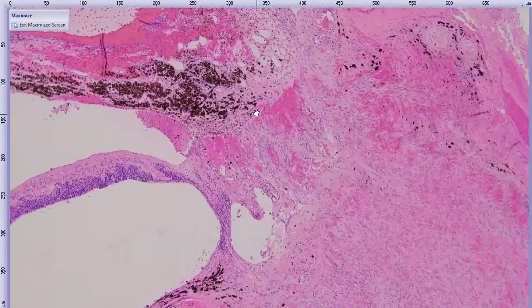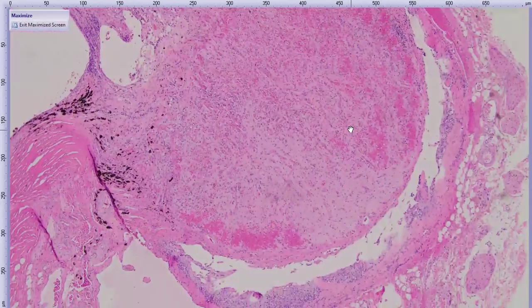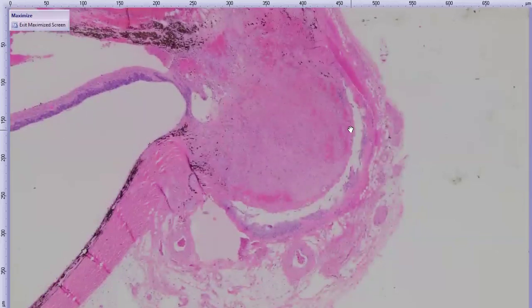Our optic nerve head, we couldn't see it grossly, but we can tell that it's a little bit cupped here. And there's a lot of hemorrhage and gliosis and stuff going on in the optic nerve. So consistent, probably, with glaucoma. All right, so this was an interesting case.